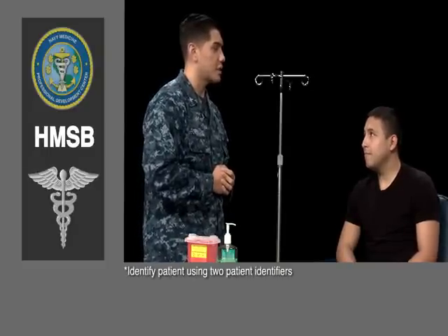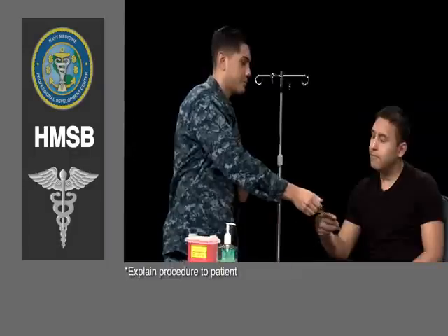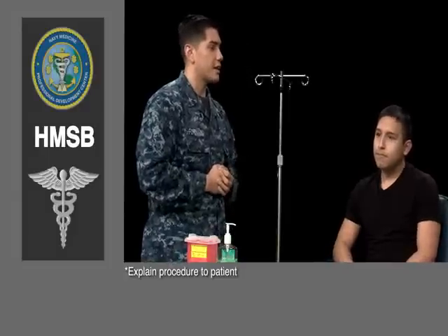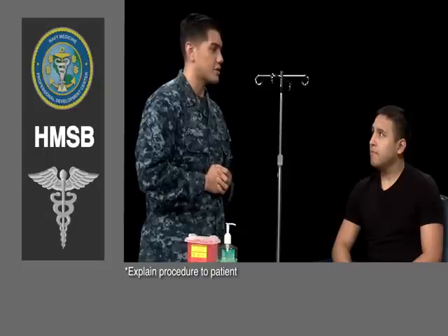Hello, sir. I'm HM3 from Mono, and I'll be assisting you today. Can you please confirm your full name and date of birth for me? My full name is Benjamin Martinez, and I was born February 20th, 1995. Thank you. So your provider has ordered that you receive normal saline at 1,000 milliliters an hour through the intravenous route. Do you have any questions before we begin? No.